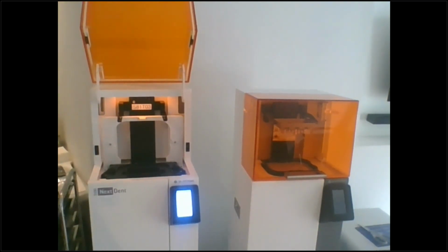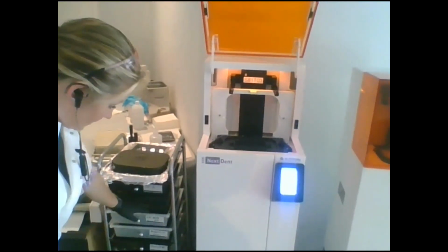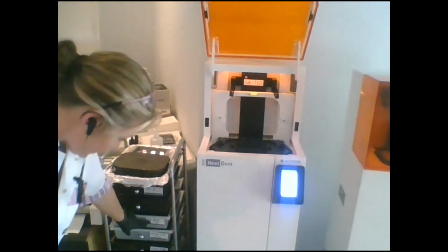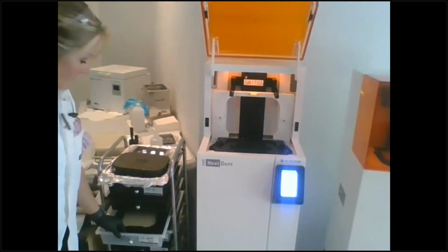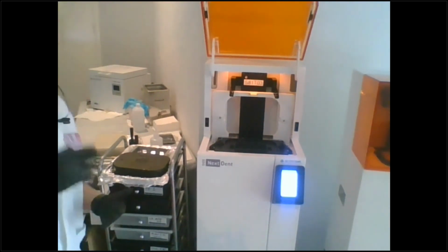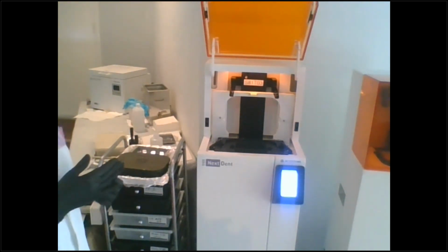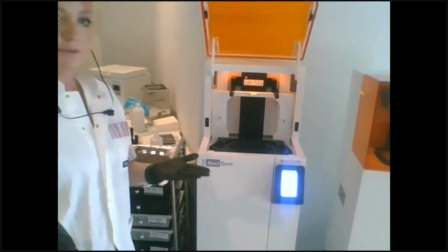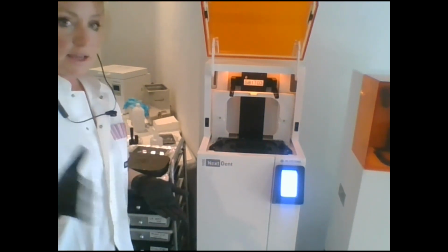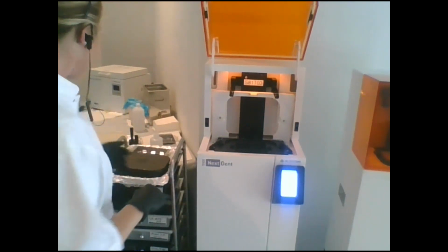So the next thing is that I was showing you guys on Friday that what I have here is a little cabinet and it has a name on it and I know that my MFH is in here and so I can take it and stir it every day. And when you're printing dentures or temporary crowns, you want to make sure that you do that because ceramic will settle. And so every couple of days, I'd say Friday night before you go home and Monday morning when you come in, if you leave it for like a week, it's going to take like 10 minutes to loosen up the ceramic from the membrane, okay?